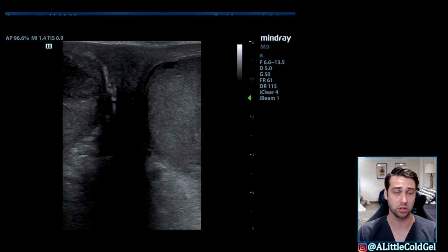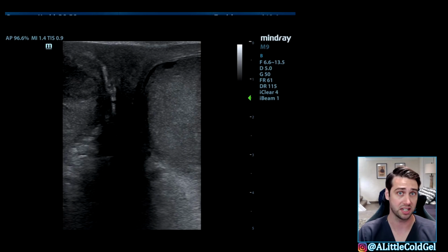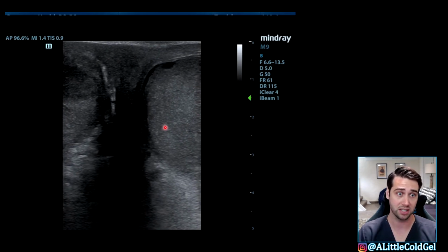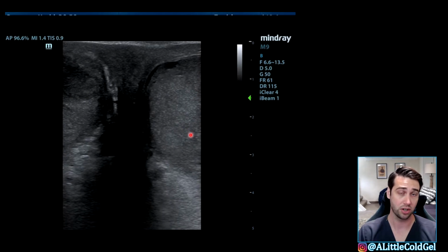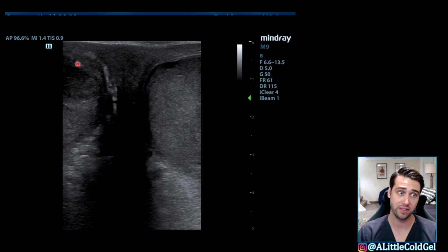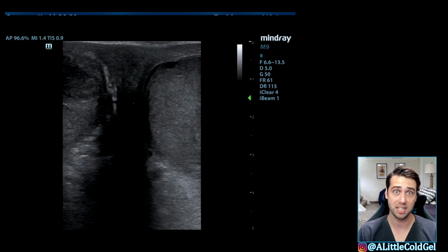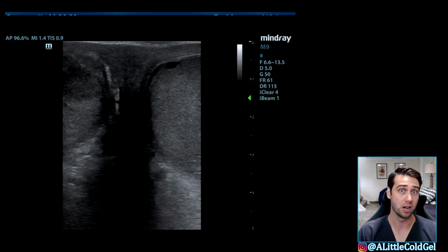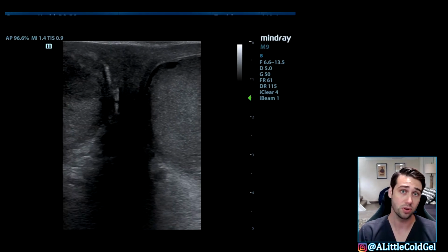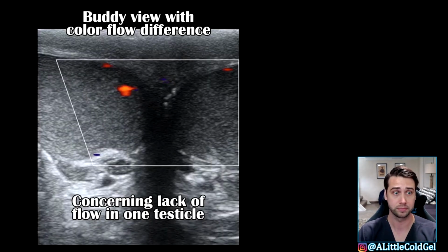The things you really want to look for in this view is basically the homogeneity or heterogeneity of the testicles. So they should be fairly homogeneous. We can see here this left testicle looks very homogeneous. There's not really any irregularities to it. While this right one over here, we do have that big irregularity right there that is different compared to the other side. And so that's the first thing you want to notice with the buddy view. Are there any differences in echo texture from one testicle to the other? And if you do notice differences, that could represent some possible pathology.